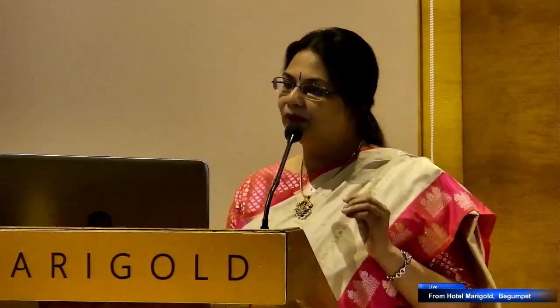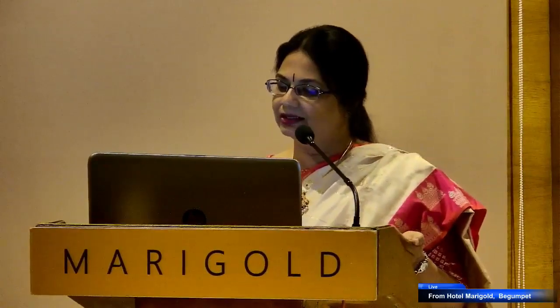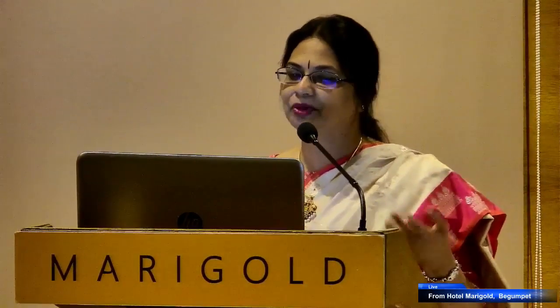Now, we all know that a great embryo, an embryo that is going to implant or has the potential to implant, a good quality embryo always comes from great gametes, viable, good quality gametes. So oocyte grading is one of the important steps in our laboratory, which gives us additional information on the embryo, especially because when we on day 3 or day 5 are selecting embryos, we are faced with different possibilities.